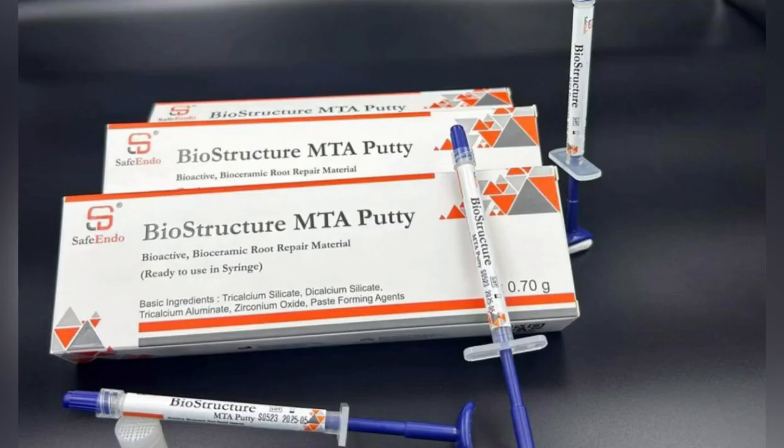Coming to this BIOSTRUCTURE MTA putty material, it is available in syringe form, containing 0.7 gram of MTA putty material. Coming to its properties, this material has a shorter setting time, that is, it sets in around 10 to 15 minutes.